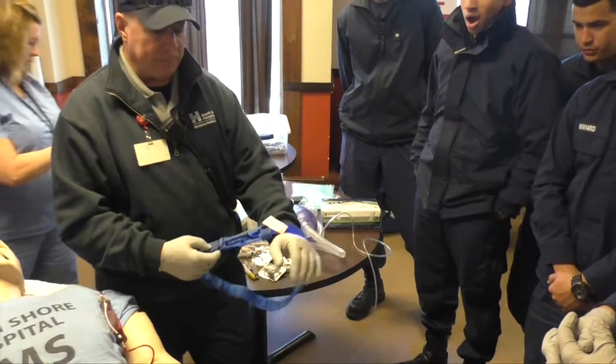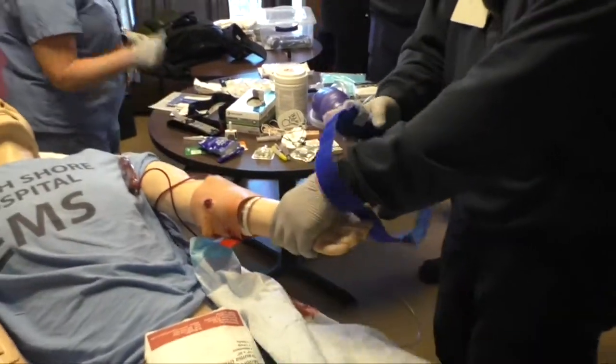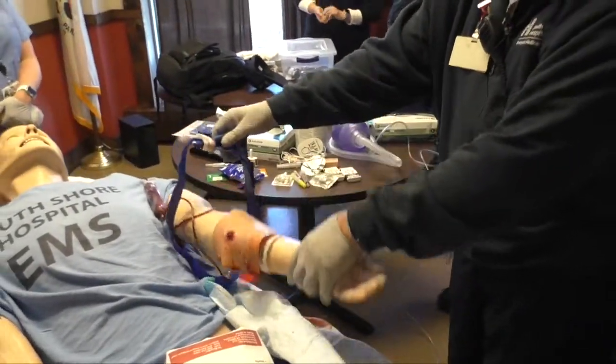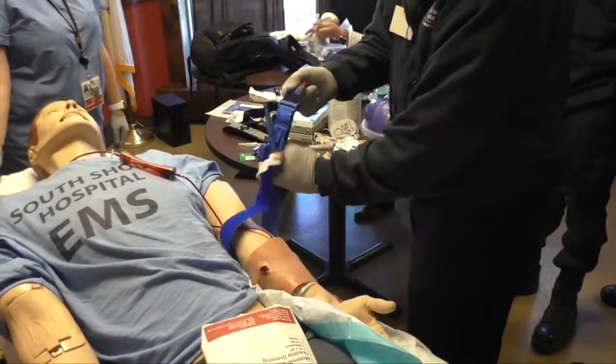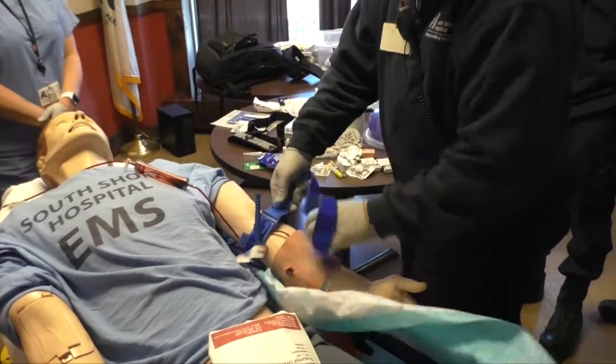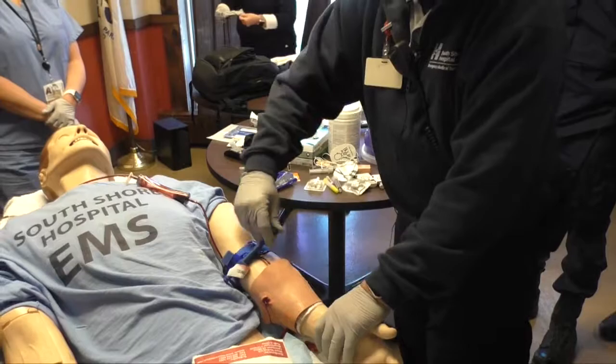If it's going to be bleeding that bad, ideally what I'd do is come up, grab their arm, put the tourniquet on my arm, slide it up over their arm, pull the tab so it goes over, and then spin the windlass.